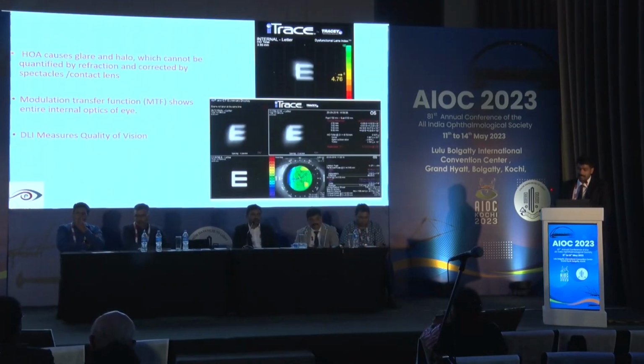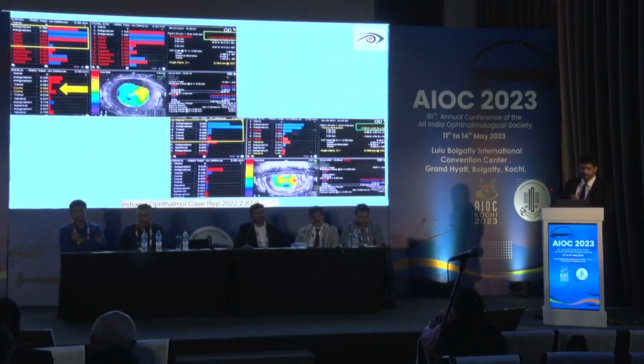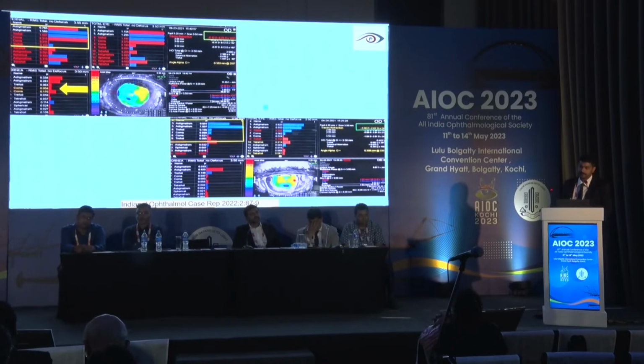And here you can see the higher order aberrations can actually directly be measured. Here you can see that the coma and the trefoil are extremely high in this case, although the surgery was picture perfect. If you ask me what do we do about this, not much, because we couldn't really find exactly what the reason is. It could be a manufacturing defect of the IOL, for all you know.